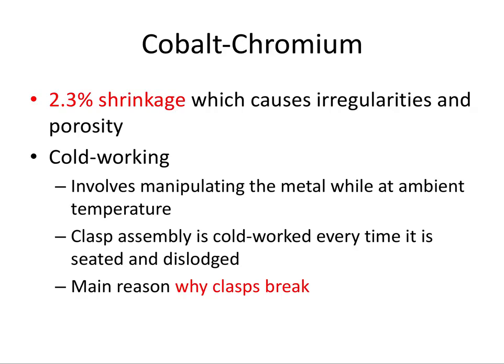And this is why the clasps break. It's the main reason why clasps break, because of cold working. And that could definitely be a question on the board exam, so I would definitely remember that one. Cobalt chromium, again, is a good framework material, but it does come with some shortcomings, particularly in terms of the clasps breaking.